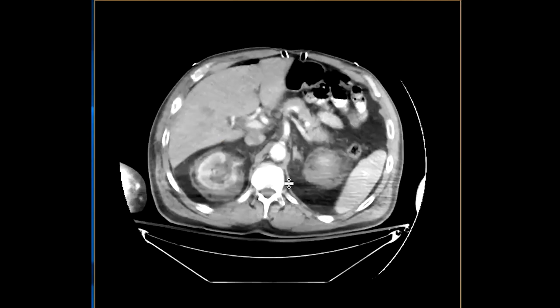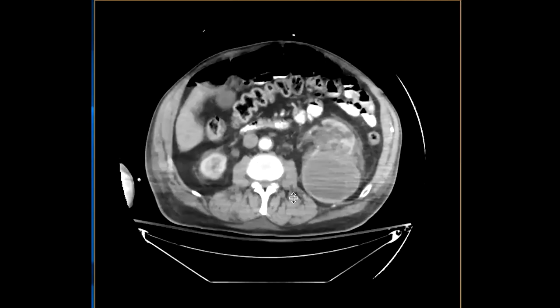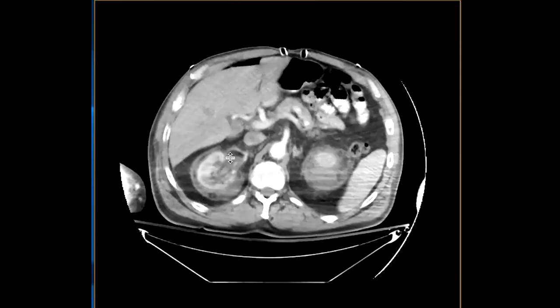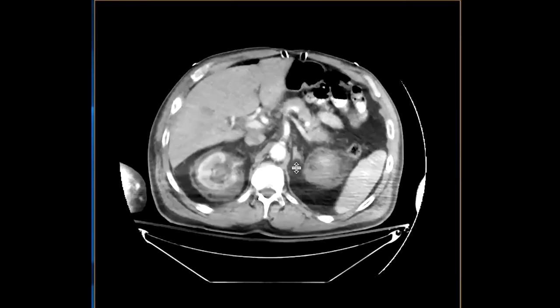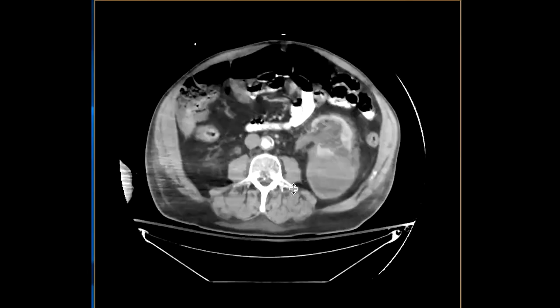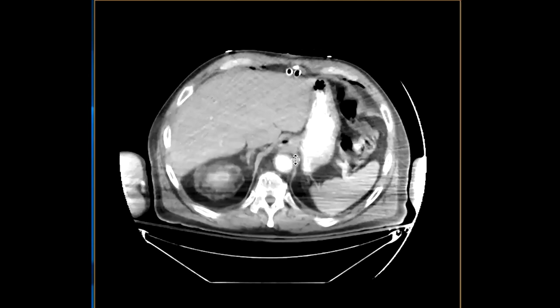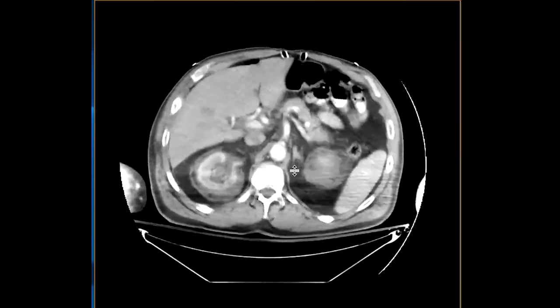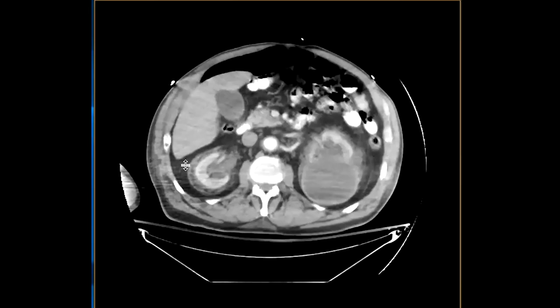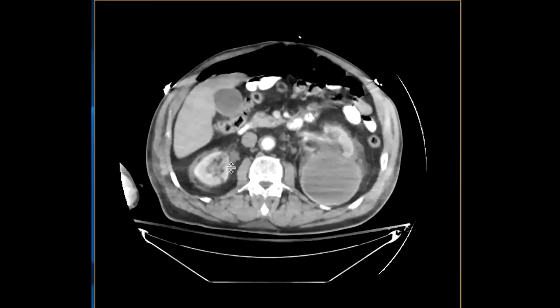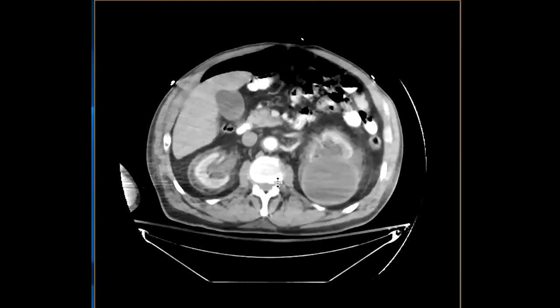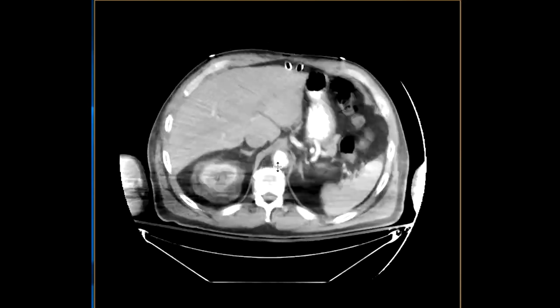The kidneys themselves look on the smaller side. But look at the fat around the kidney — notice there are rinds of soft tissue in that location. This is more than just peripheral stranding. This really does look like quite thick rinds of soft tissue surrounding the kidney, perhaps involving the renal sinus and maybe surrounding some portions of the ureter as well. That is an unusual look, but it's there.